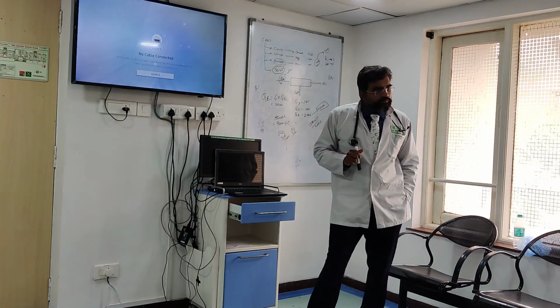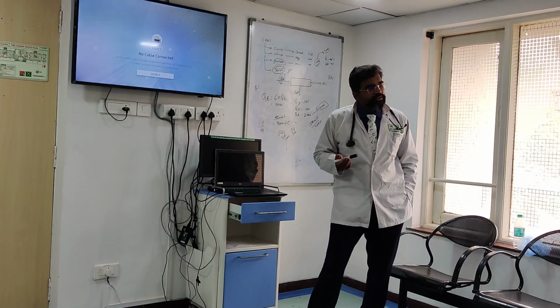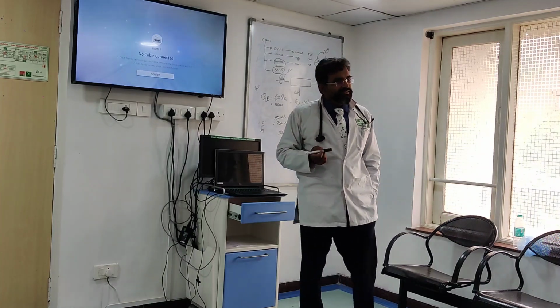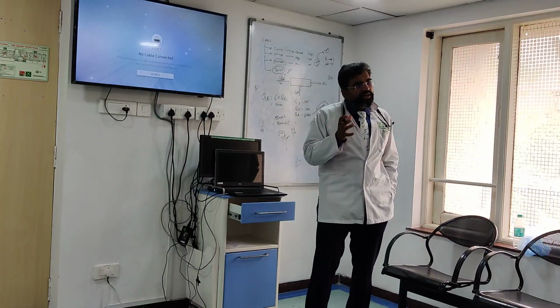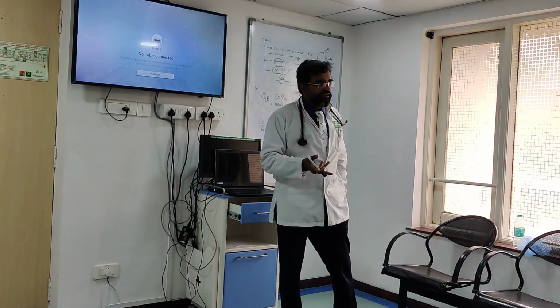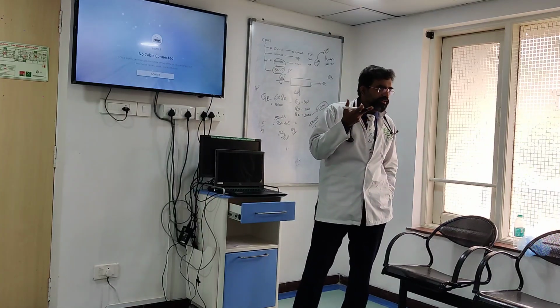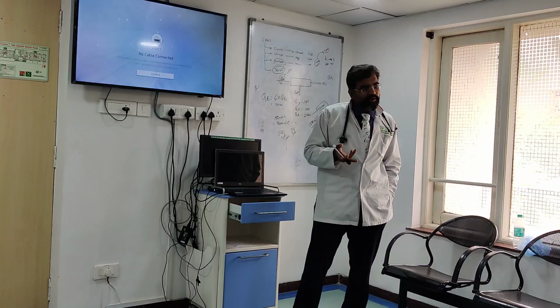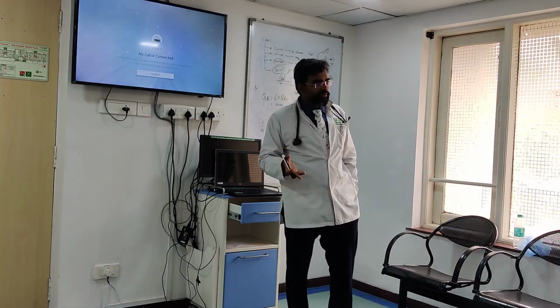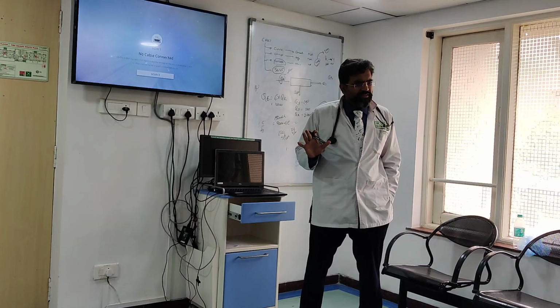So what if we decrease the replacement fluid? Then your convection will be decreased and then your myoglobin will not come out. At the end of the day, you are actually doing a titration. You are doing a titration, and then you are repeating to see what is happening. If you reduce the convection, the amount of flow will reduce, the myoglobin coming out will reduce. Simple. Myoglobin coming out is our main thing. You will not be able to take it off. Understood? Any queries?